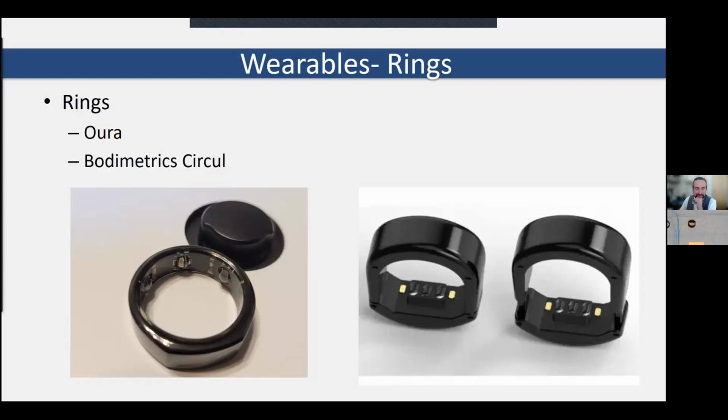So we brought in two wearable rings, and they demonstrate a few different things that we want to talk about. One is the Oura Ring, and if you have searched for the Oura Ring at all within the last 6 to 8 months, you will see ads for it everywhere you go. They are really promoting this device, and it is a really compelling device. Where smartwatches are more active in how they interact with you, these wearables are a lot more passive, meaning that you just wear them and it collects a variety of data, and it gives you some insights into some of your health trends.